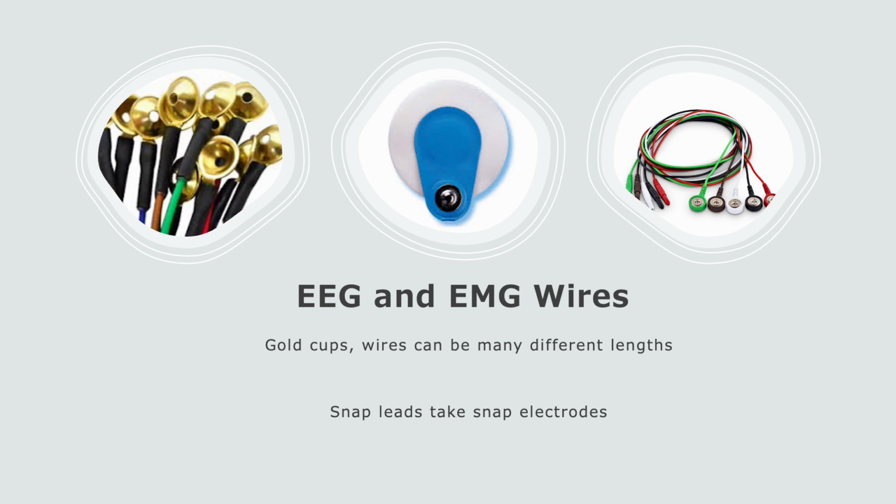The only good way to make sure a wire is still good is to use an impedance checker or a wire checker, where you hook in a wire to these two places on this little thing, and if the light lights up, that means you have a good wire.